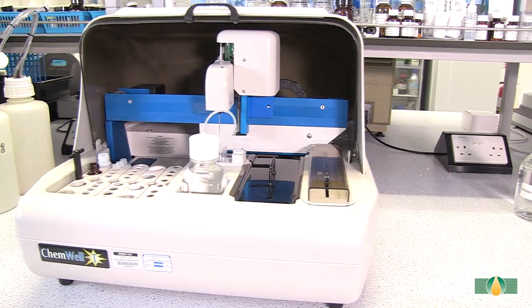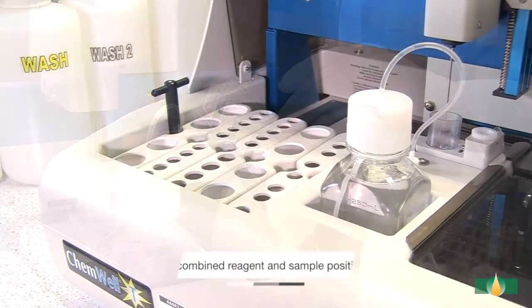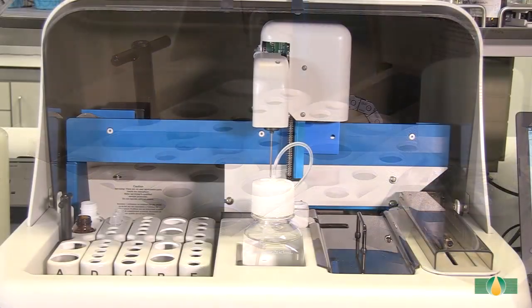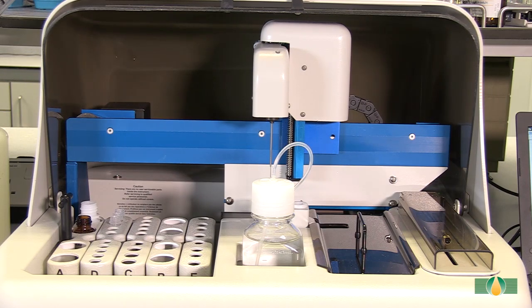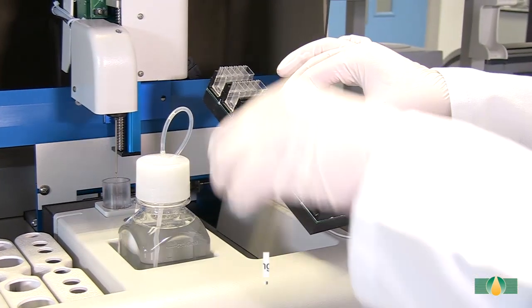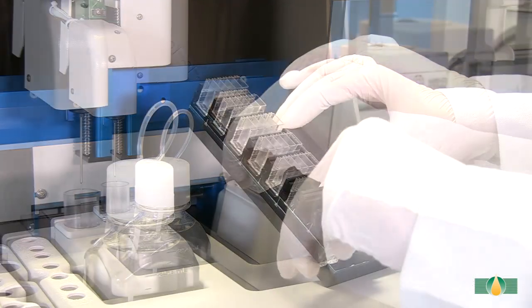The ChemWell-T performs biochemistry assays in one centimeter path length cuvette strips. Equipped with 35 combined reagent and sample positions, it is capable of performing 40 tests without intervention at up to 100 tests per hour. Cuvettes are easy to load and unload, and the continuous loading capability allows tests to continue with ease.